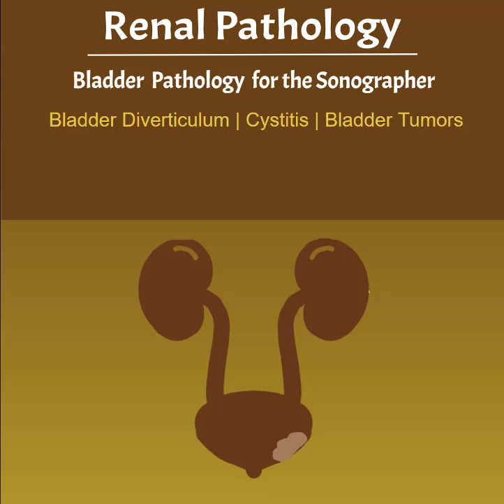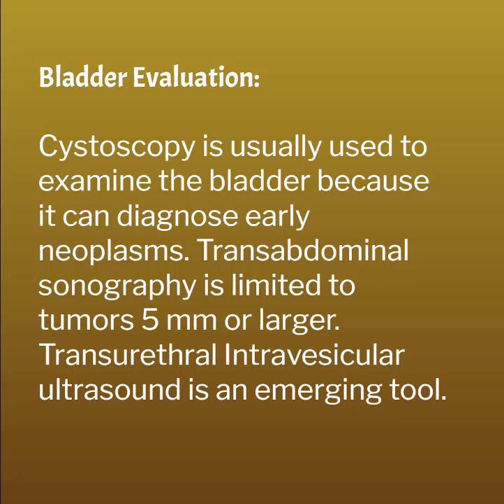Welcome to our sonography lecture on renal pathology, part 13 of 14, bladder pathology for the sonographer. This lecture will cover bladder diverticulum, cystitis, and bladder tumors.